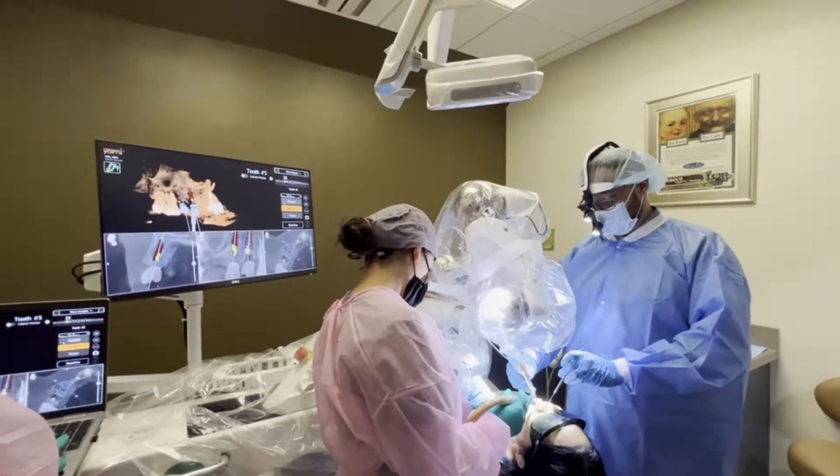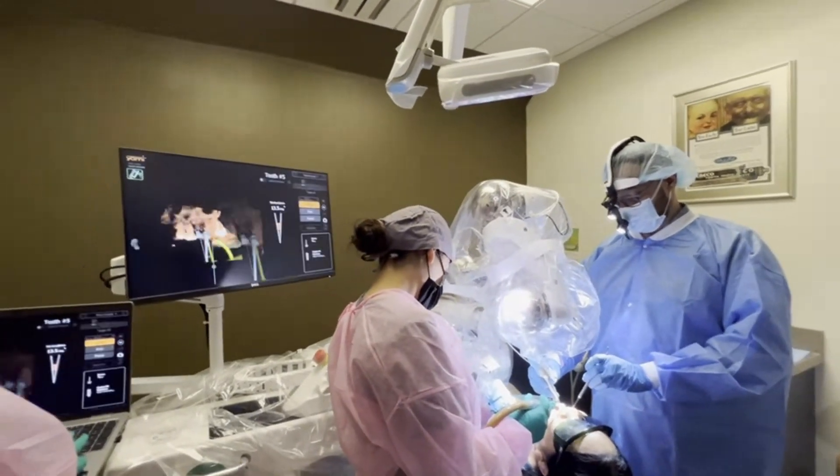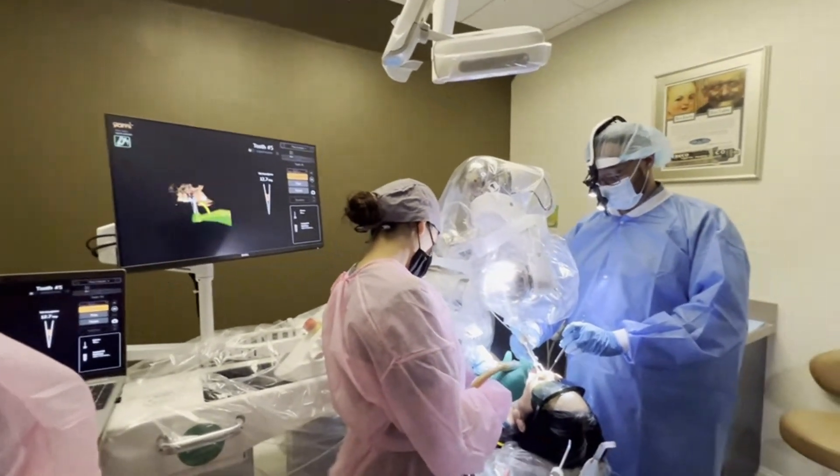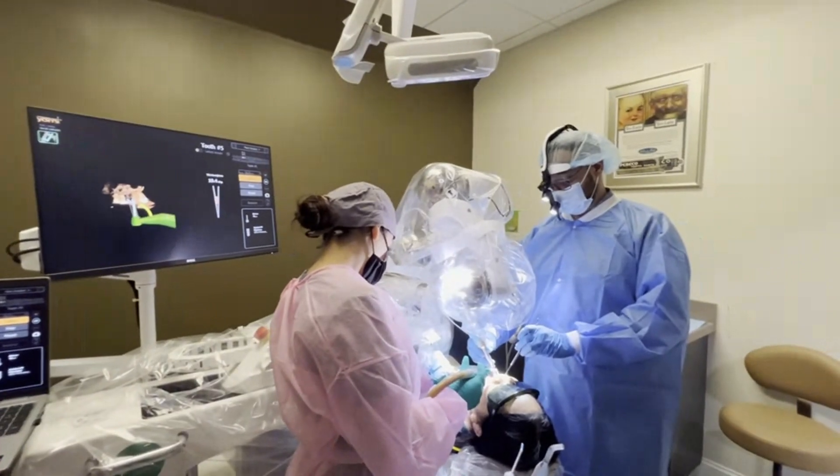Right in, right in. Tilt up towards the nose 12 degrees.